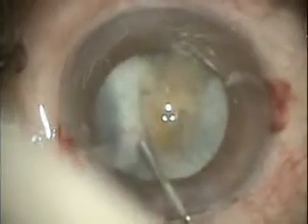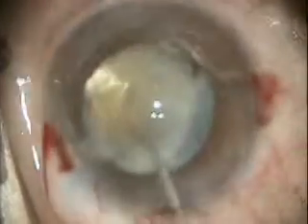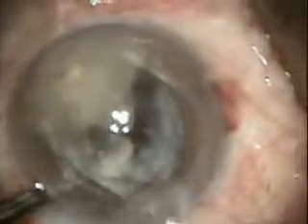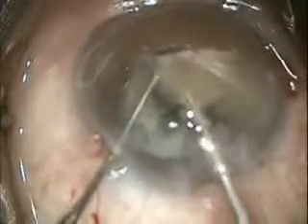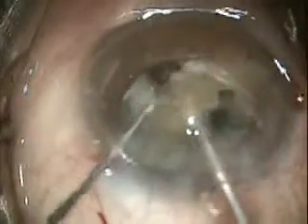As you note here, during the cataract surgery, the surgeon realizes a posterior capsular rent with a small amount of vitreous prolapse. The last nuclear fragment is brought into the anterior chamber, viscoelastic is injected, and the hydrophilic acrylic foldable IOL is gradually pushed into the sulcus. Note that the leading haptic goes in the sulcus while the trailing haptic rests over the iris. This acts as a support to prevent the nuclear fragment from falling into the vitreous cavity, and the nucleus can then be emulsified.